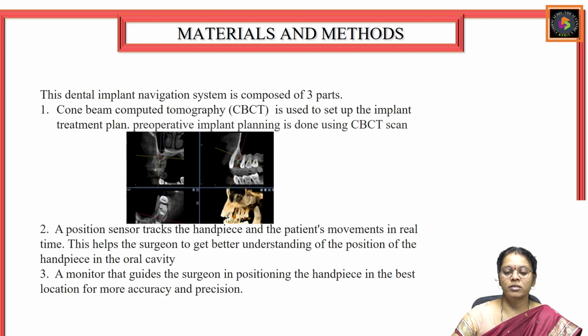But the problem with this technique is that real-time visualization of the operating site and any corrections of the errors which occur while implanting cannot be done in the static navigation system, and hence the problem persists with respect to the subjective nature of the surgeon. If he is very skilled enough wherein he is not making any errors, then fine, the surgery will be successful and the implantation will give a good aesthetic look. But if the surgeon is not doing it well and there are a few errors in the implantation, then the implantation would result in a failure and even disturb the aesthetic look of the patient also.